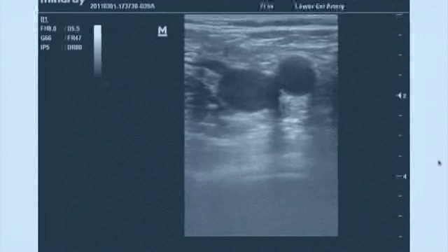So Matt, do I want to be above, below this, or right at this level? Be right at this level. You can compress a little above it, a little below it, and a little right at it, but the important thing is seeing that saphenous take off. Yes. Okay. These studies are talking about these 2-point compressions, and so theoretically you're just compressing right here as your point number 1. So if I just put my probe down on the thigh and I see artery and I see vein, that's not enough. I got to find the saphenous. That's what you're telling me.